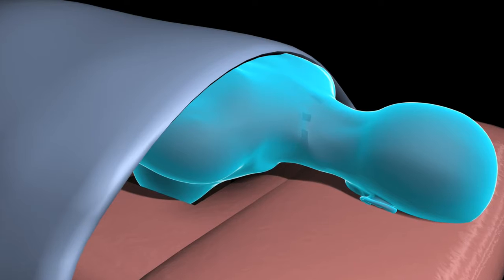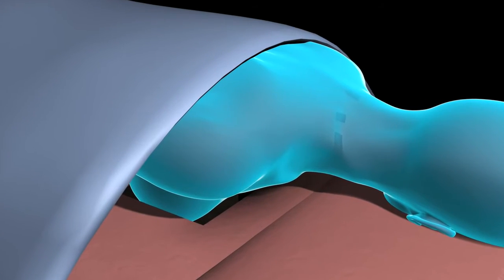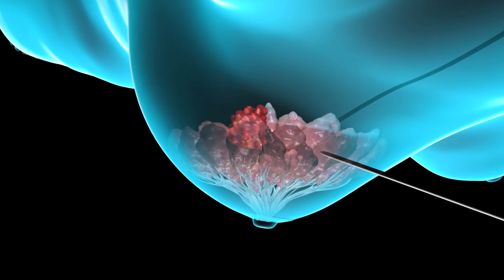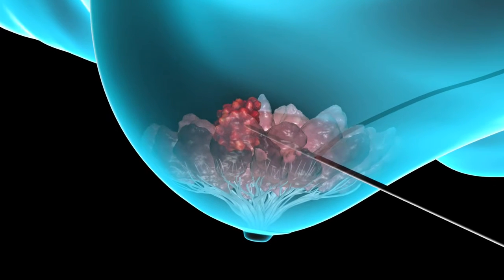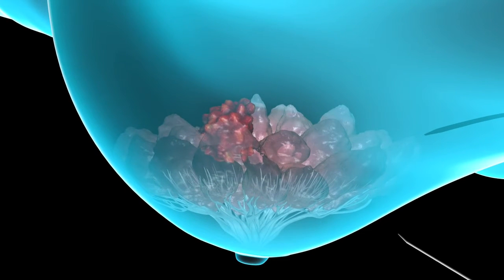For a stereotactic core biopsy, you will lie face down on a table with your breast visible through a hole in the table. Guided by a computer-generated mammogram of the suspicious area, your physician will insert a hollow needle into the breast mass and remove several small cylinders of tissue for examination.